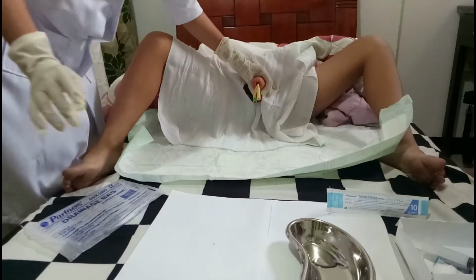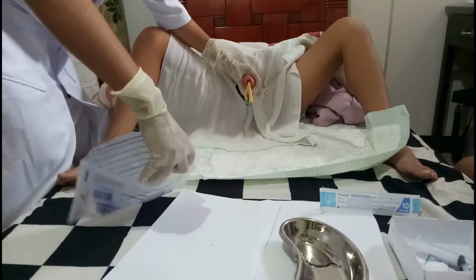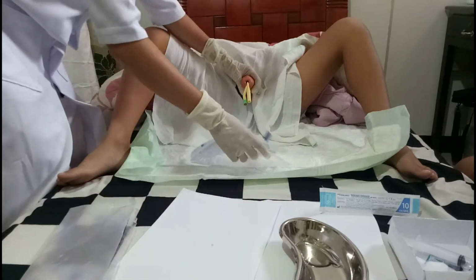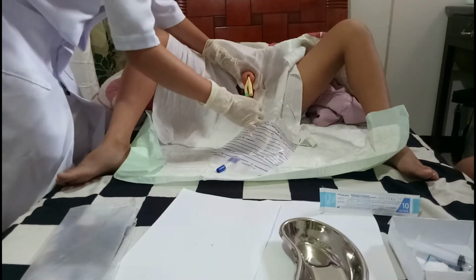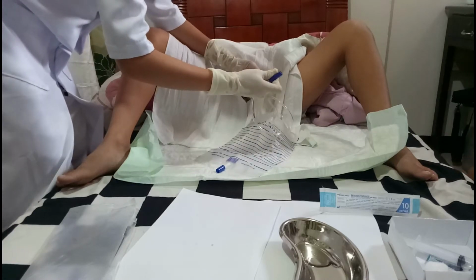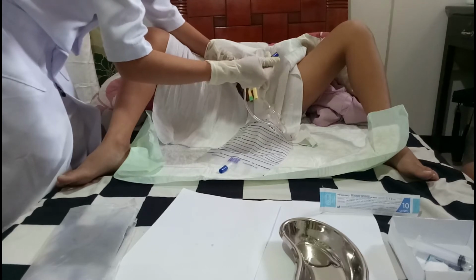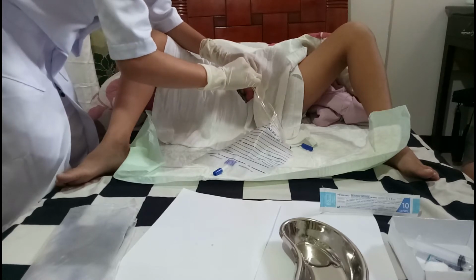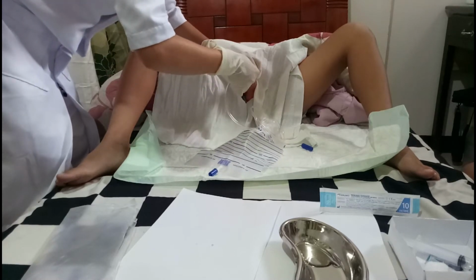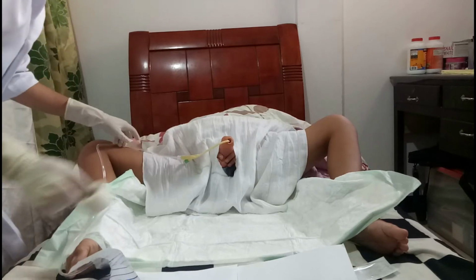Then, discard this one. So now I'm going to prepare the urinary bag. And insert this one in here. Sir, I'll attach the catheter here, okay?